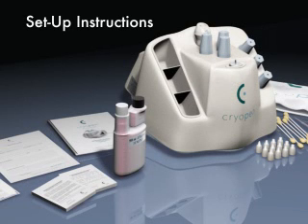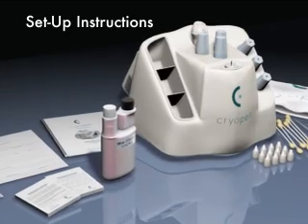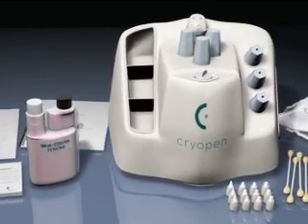Thank you for your recent purchase. If you purchased a different model other than what is shown, the setup steps, cryosurgical procedure, and postoperative instructions will be the same.